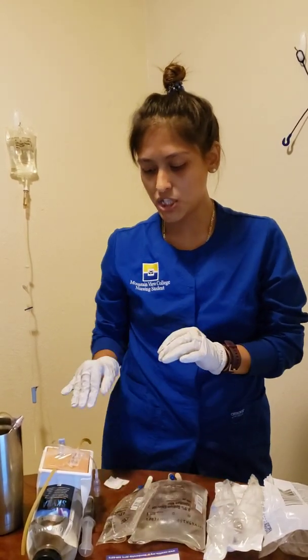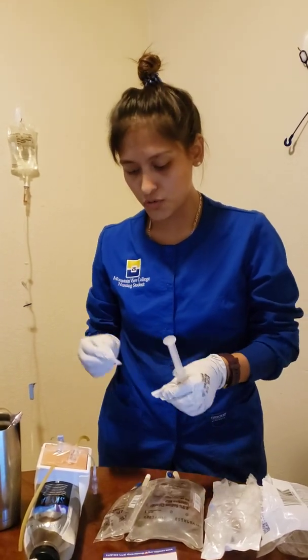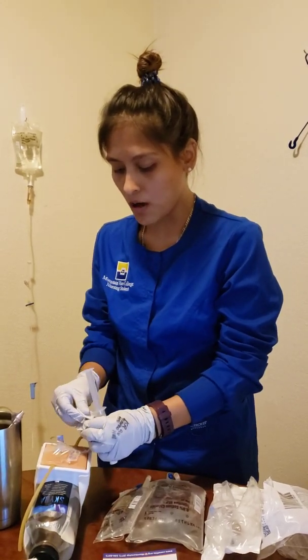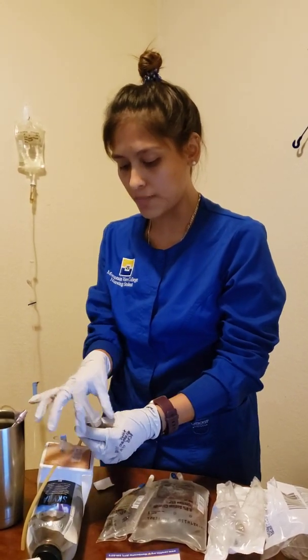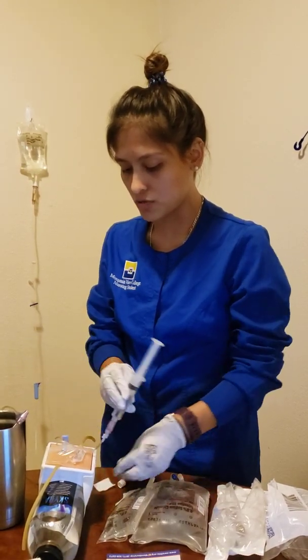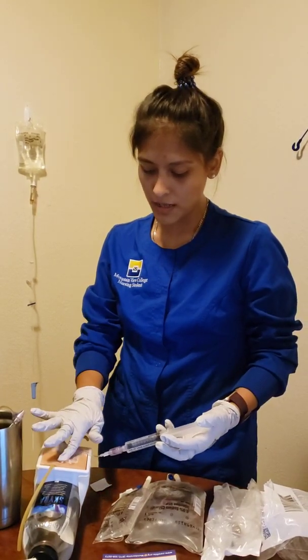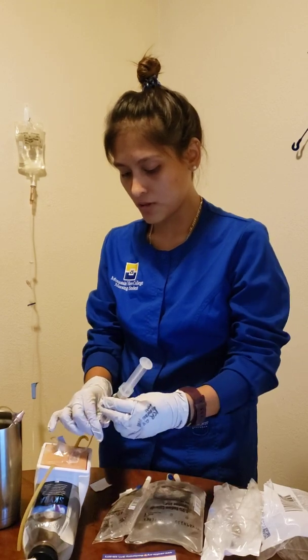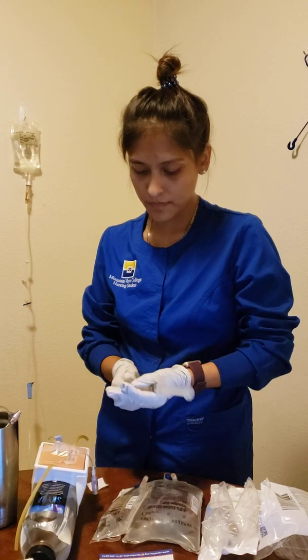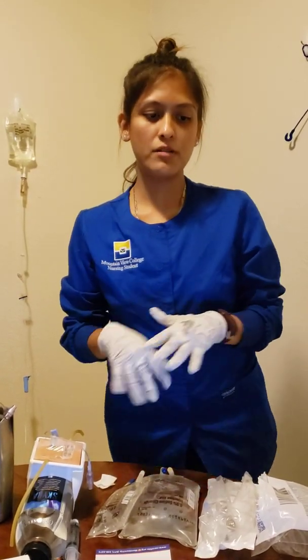I see that she has an IV in place already in her right forearm. So I'm going to want to assess her IV. I'm going to come here and clean it off. And I'm going to want to make sure that I can flush. And again, there's no redness, there's no infiltration noted. So I'm flushing, making sure it's good. And it's a good IV. So I'm going to leave that there. Thank you very much, Miss Chi. And I've already flushed about 2 ml in there.